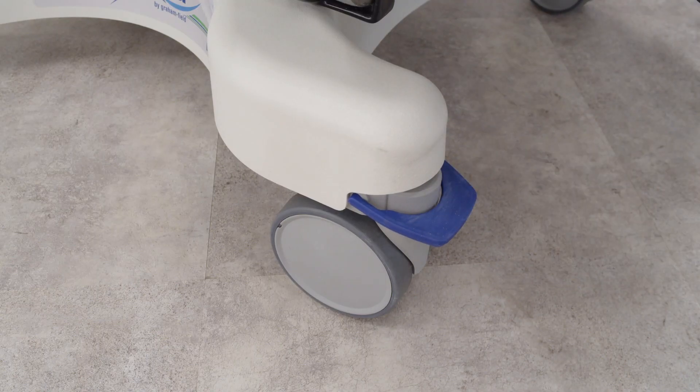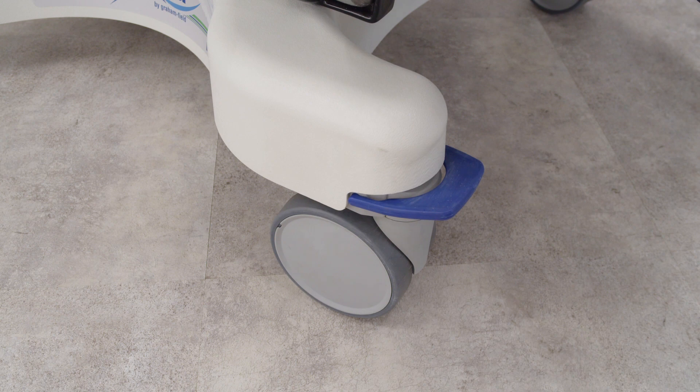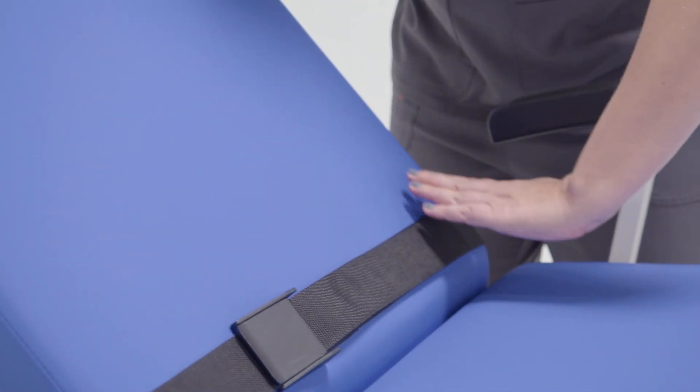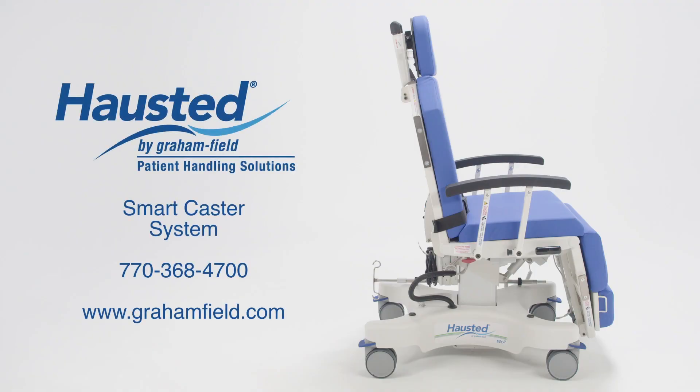All of the smart caster functions can also be achieved manually with your foot via the blue tabs as well. We hope that this overview shows you how to easily maneuver your Hosted ESC2 procedure chair. For any additional questions, please contact our GF customer service team at 770-368-4700.